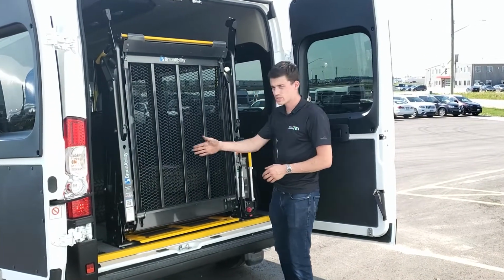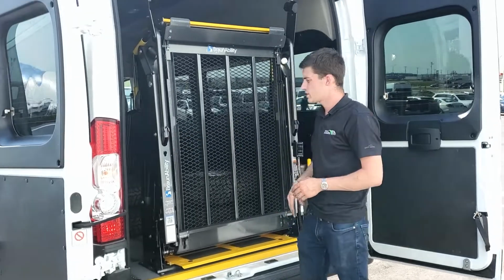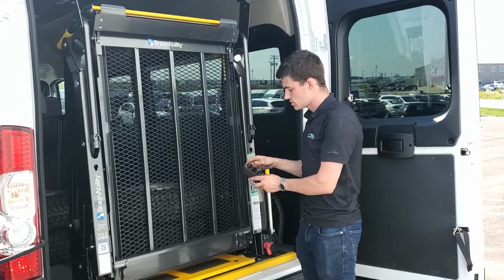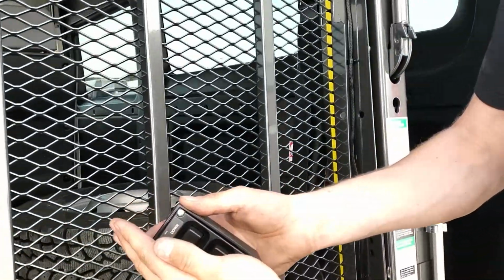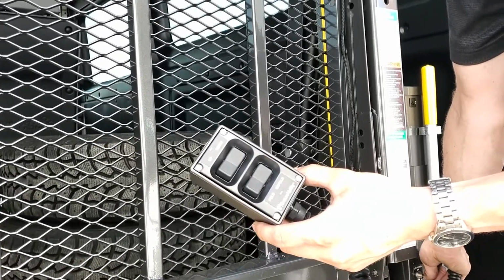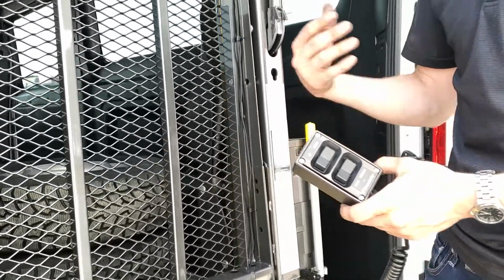Sometimes you will find that one side catches and the other side hasn't. What will happen is in these arms there are safety limit switches, and if broken, or when I say broken, they are separated when they shouldn't be, the lift will actually stop working and the controller will stop working. Now you can see, I know it's a bit sunny, but in here the fold, unfold, up and down words are lit, and I'll just turn the lift on and off and you can see them change. Anytime those are not lit, that means that a safety switch is broken.